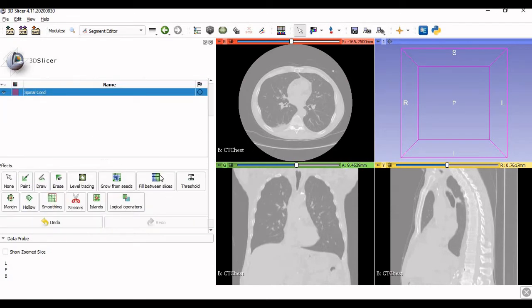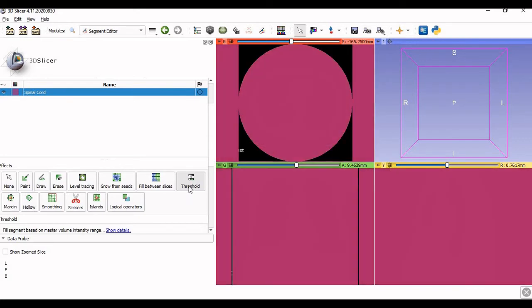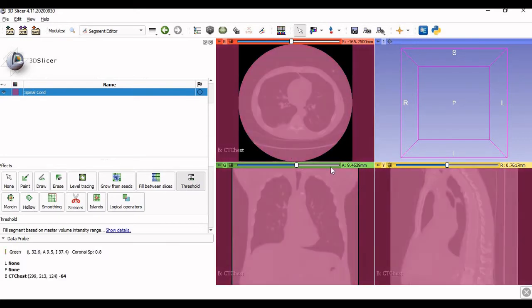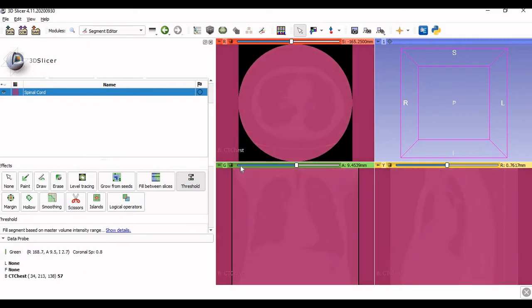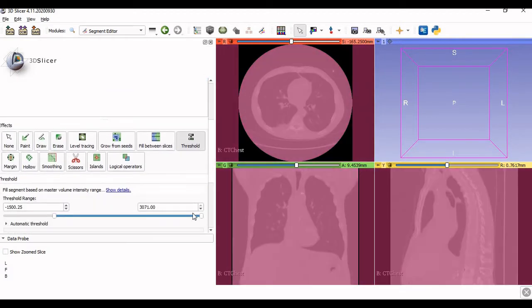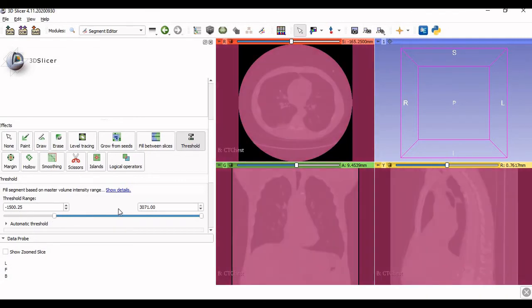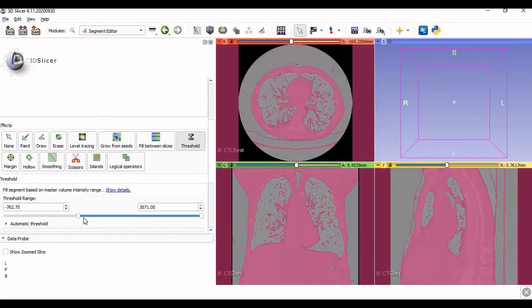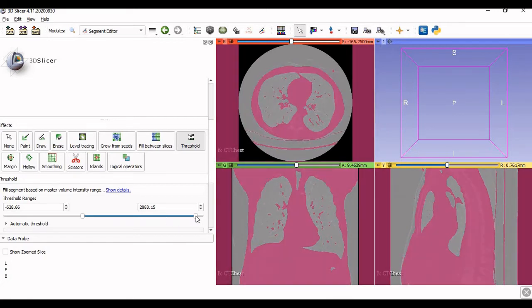In order to do segmentation, there are many tools available. The best tool I prefer is segmenting using the threshold value — once segmented, other tools can be used for editing. Once you click on threshold, whatever appears pink is being selected. To separate the spinal cord, you can change the threshold value either by adjusting the slider bar or by manually entering values. Initially it is better to slide the bar and see what is being displayed on screen.